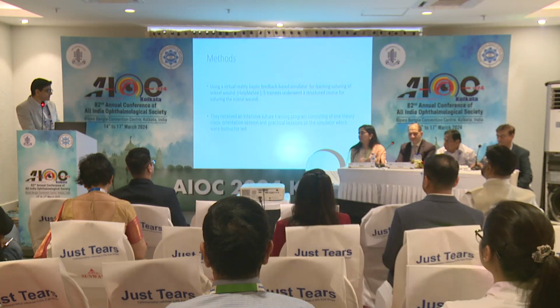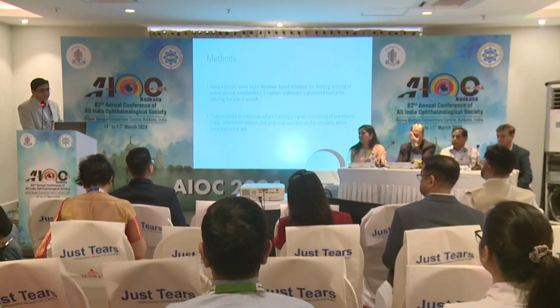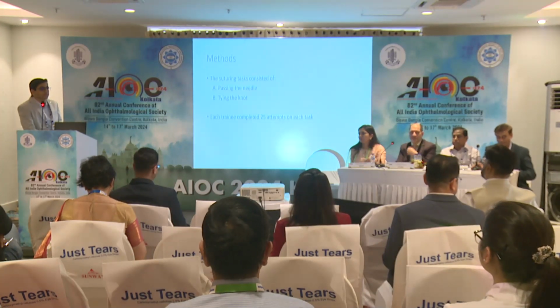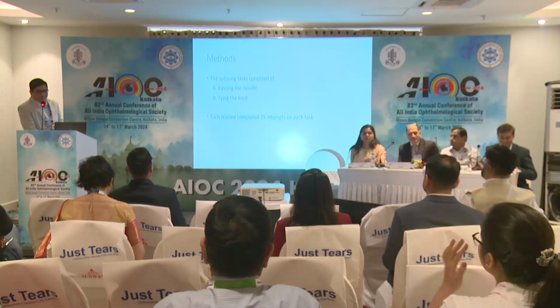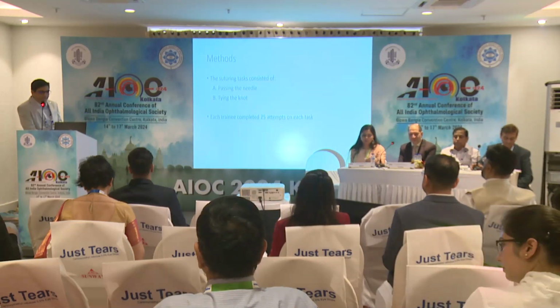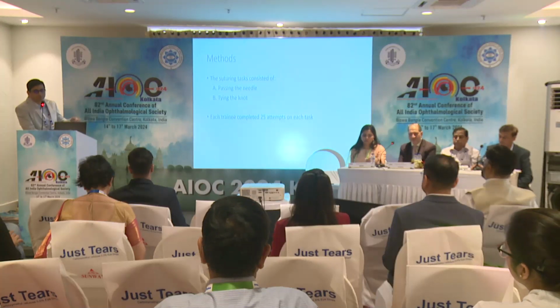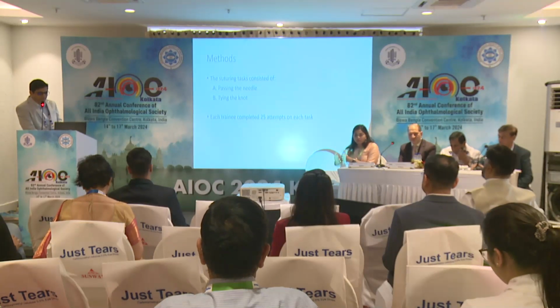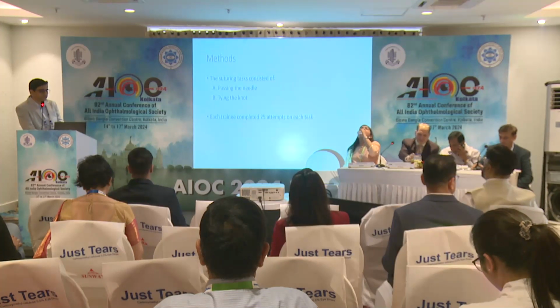We identified 5 trainees who underwent 2 tasks on the simulator, and they received first orientation on the simulation, which included theory class orientation sessions and practical sessions on the simulator, which were also instructor led. We focus mainly on 2 basic steps where we know the residents and the trainee find difficulties: passing the needle to the correct depth, involving the correct length from the incision, and tying those knots, especially the 3-1 or a 3-1-1 forward, reverse, and forward technique. And we help the trainees achieve such 25 tasks.